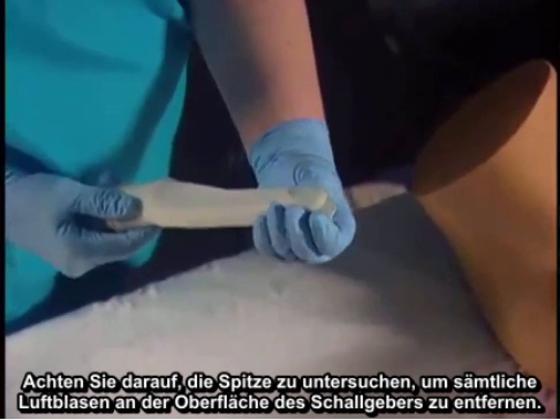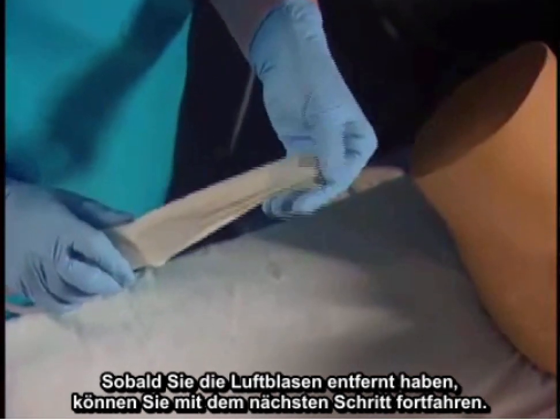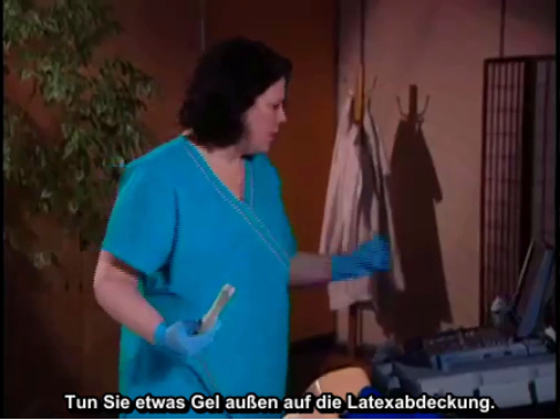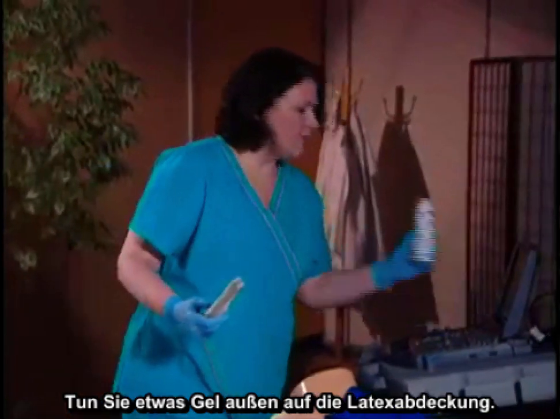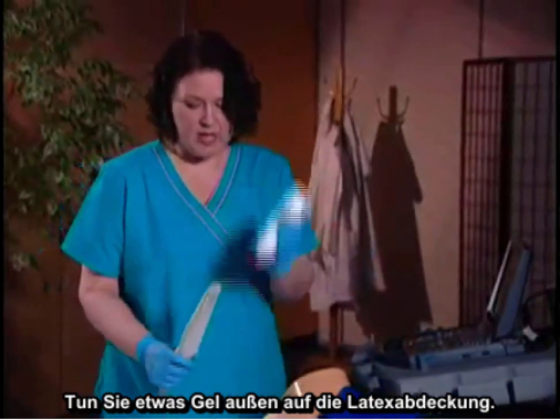Once you've got the air bubbles eliminated, you can move on to the next step. We're going to put a little bit of gel on the outside of the latex cover.